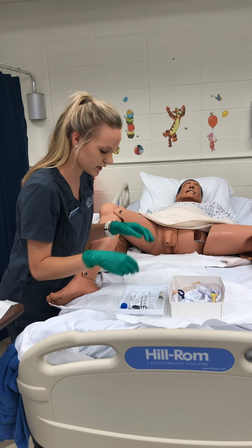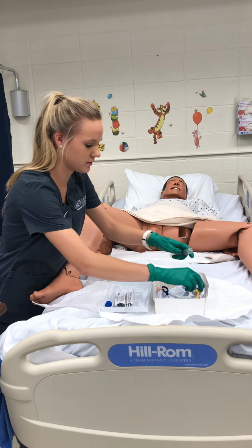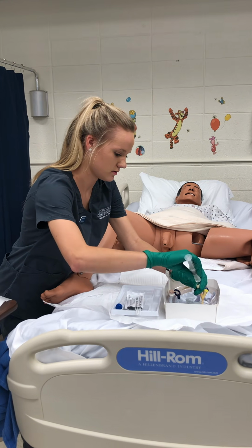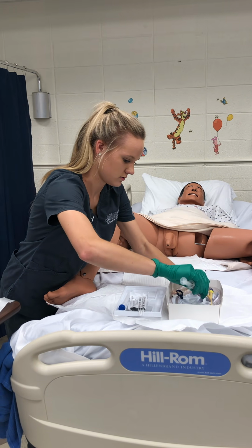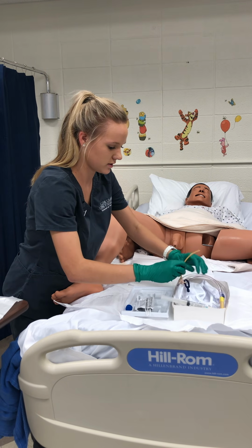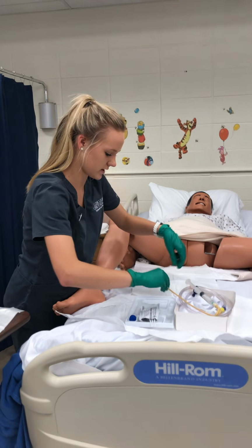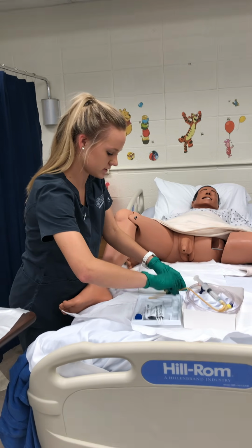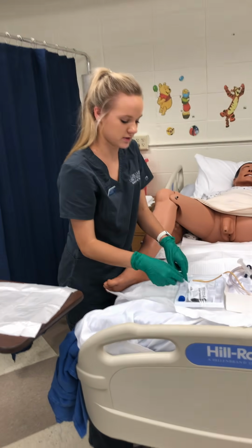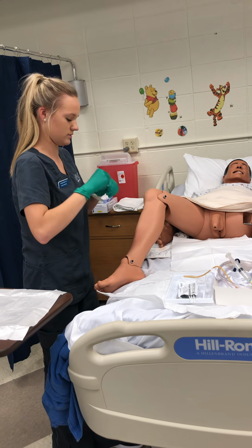And I'm going to go ahead and hook my syringe up. I'm going to go ahead and lubricate the top of the catheter, 6 inches. Okay, so this container here is if I needed to collect the urine specimen and I don't, so I'm gonna go ahead and get rid of this.